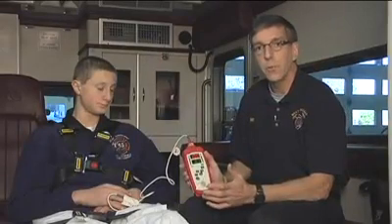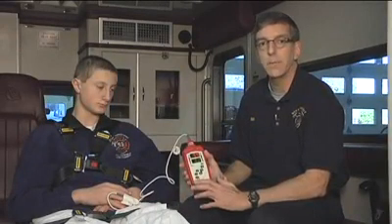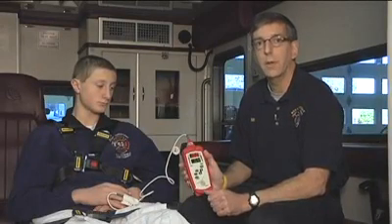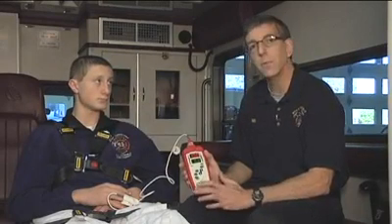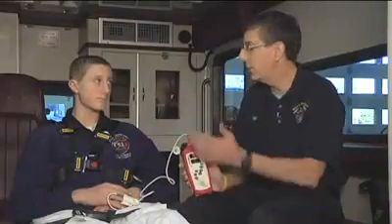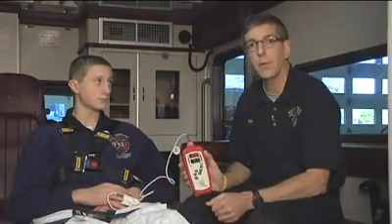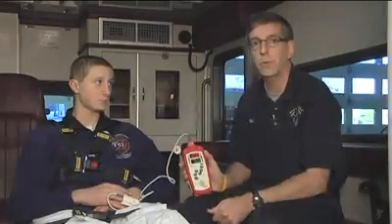Some of the issues with pulse oximetry have to do with things it may detect other than oxygen in the patient. It's looking at the hemoglobin and determining the saturation of the hemoglobin with oxygen. It could be fooled — as firefighters know — by carbon monoxide. Conventional pulse oximeters are unable to tell the difference between oxyhemoglobin and carboxyhemoglobin. So if a patient was pulled from a fire with a 20% carboxyhemoglobin carbon monoxide level, the pulse ox would still read 100%, not recognizing that 20% of that was carbon monoxide. That's the first caveat about using pulse oximetry.